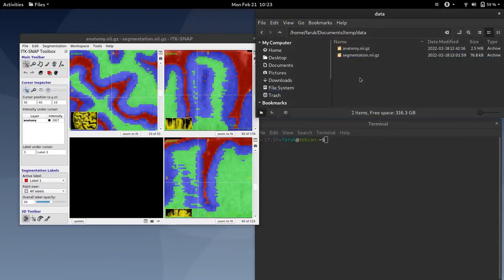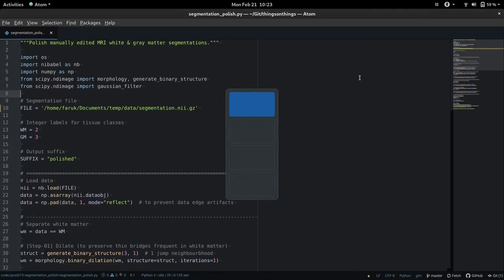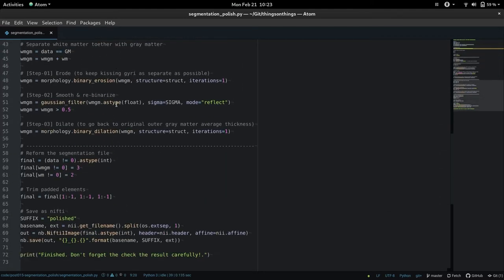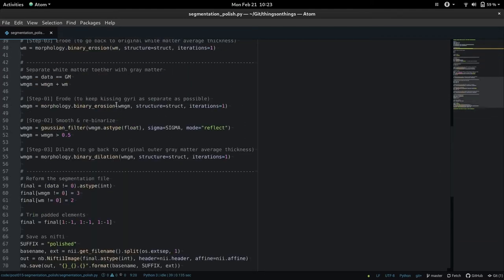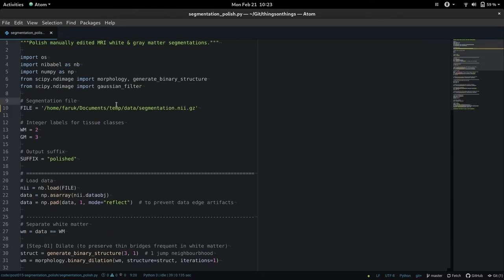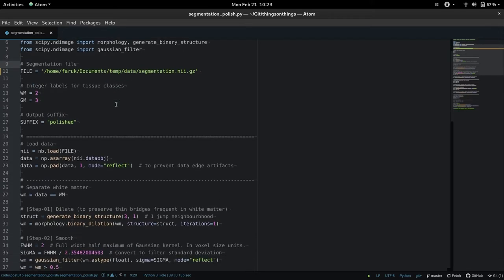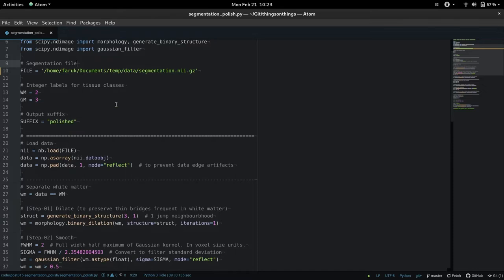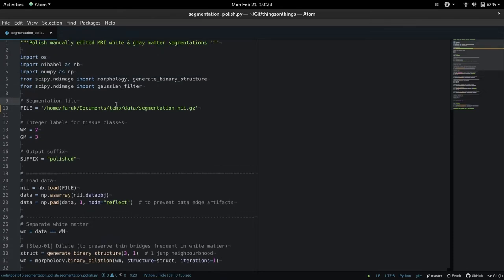So I'm going to link in the video description a script. But basically I have written a Python script that uses simple image morphology operations like erosion, dilation and a bit of Gaussian smoothing to regularize these borders.